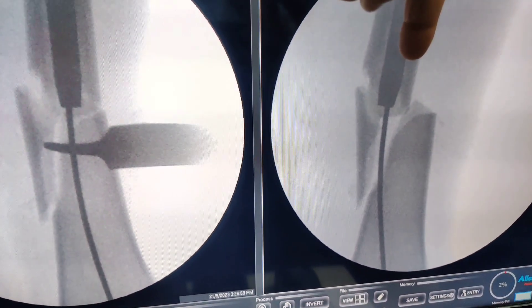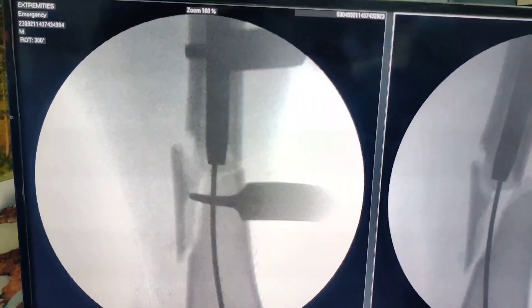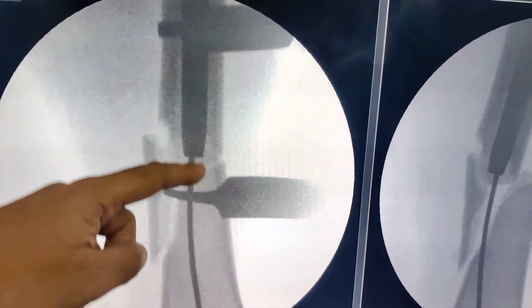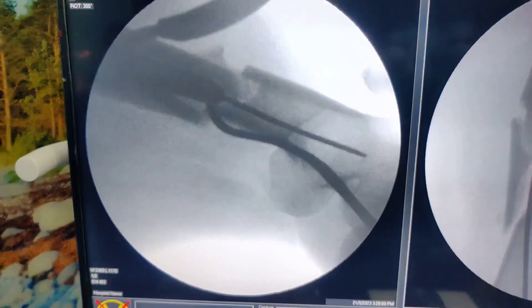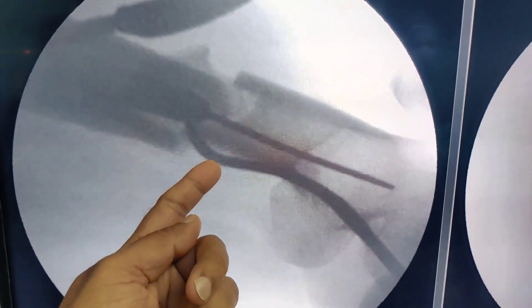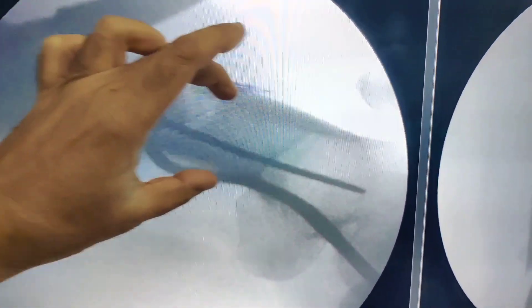This is before reduction, and now once we have put the Hohmanns you can see that this is nicely aligned. When you pass the nail it is not going to hit the cortex — it will go straight down. On the lateral view you can see the Hohmann is in the distal fragment and now there is no flexion of the distal femur.